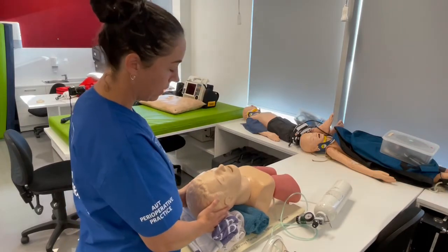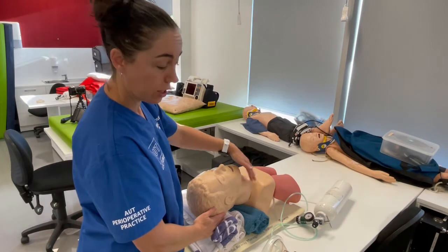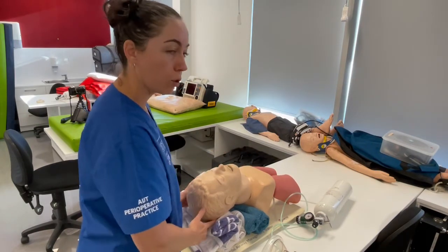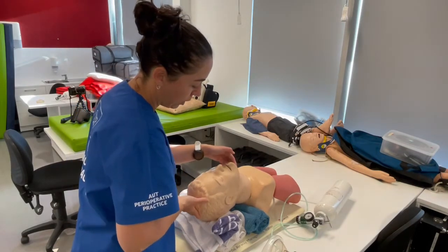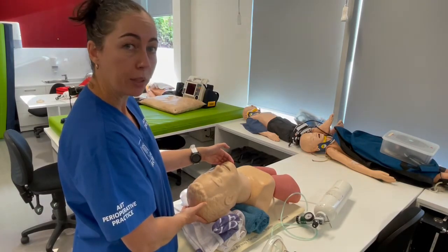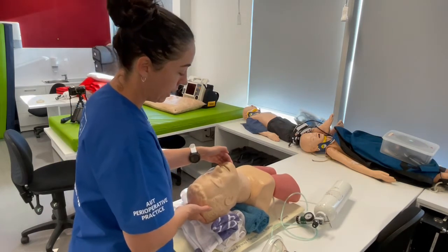So that's point one — the sniffing position: neck flexion and head extension. Your two airway maneuvers: head tilt chin lift is maneuver number one. It's as simple as pushing the head back and lifting the chin up — it doesn't matter whether the mouth is open or closed.